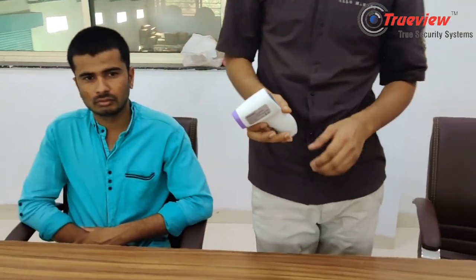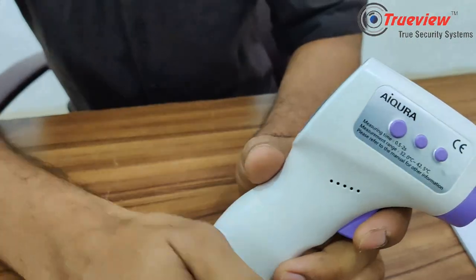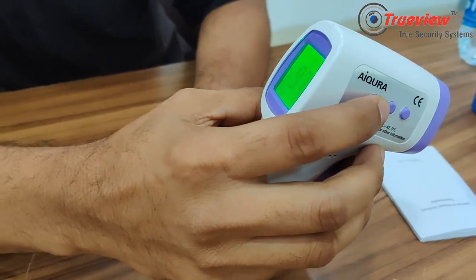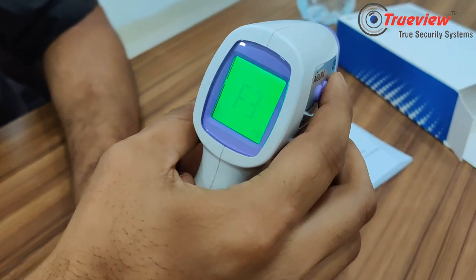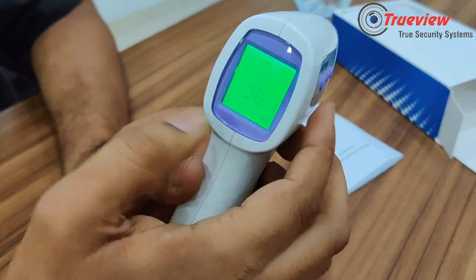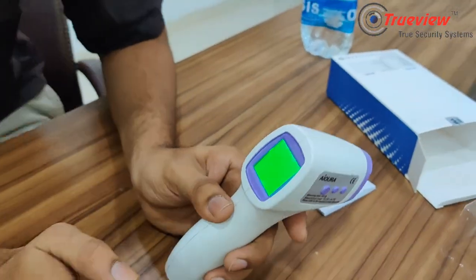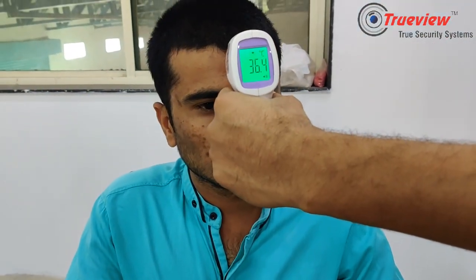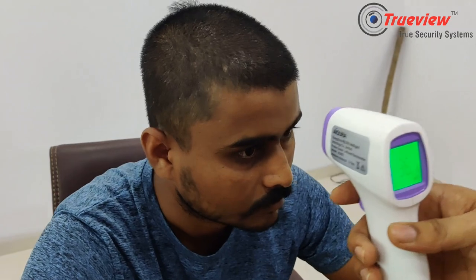If you want to show the measurement in degree Celsius, you need to change the settings using the mode button. You can press the second button to switch. In degree Celsius, the reading is 36.4. For the second person, press the second button again — the reading is also 36.4°C.